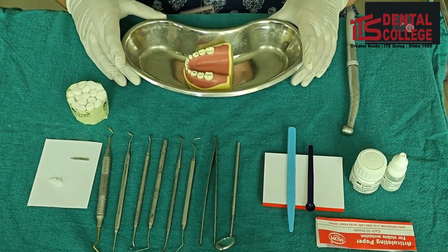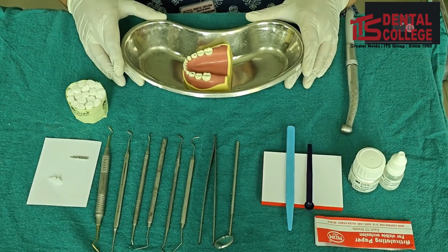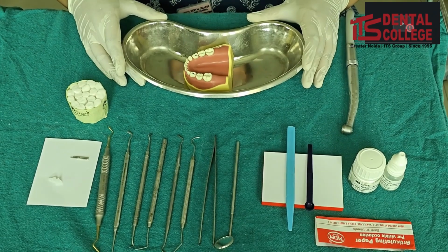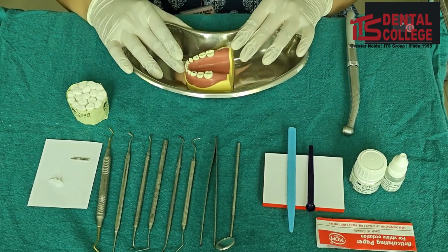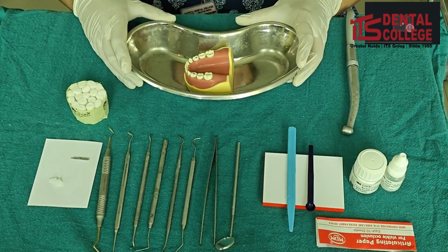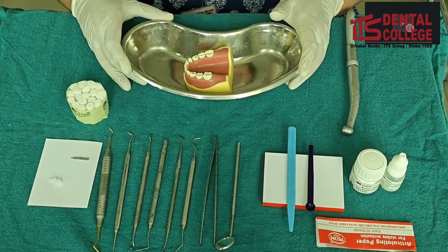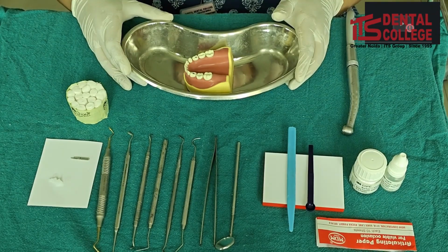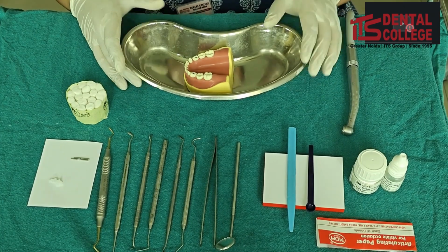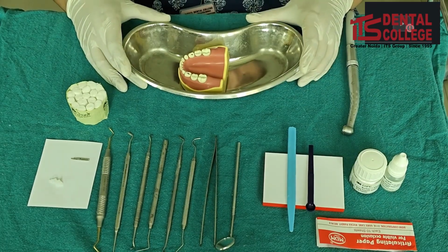There are 9 types of glass ionomer cements. Type 1 luting GIC, Type 2 restorative GIC, Type 3 liners and bases, Type 4 for pit and fissure sealants, Type 5 orthodontic cements, Type 6 core buildup, Type 7 high fluoride releasing, Type 8 atraumatic restorative treatment, and Type 9 pediatric GIC. Today we will be preparing a cavity in a primary molar for a type 2 restorative GIC.